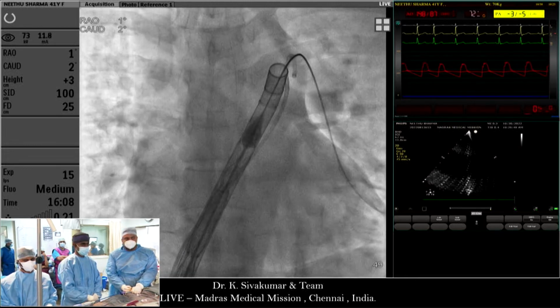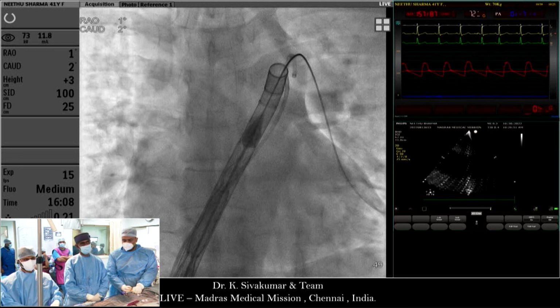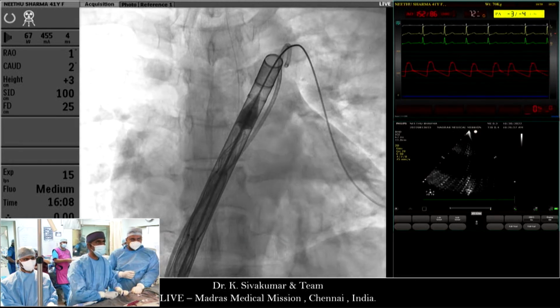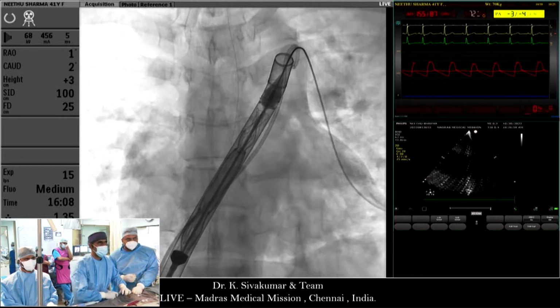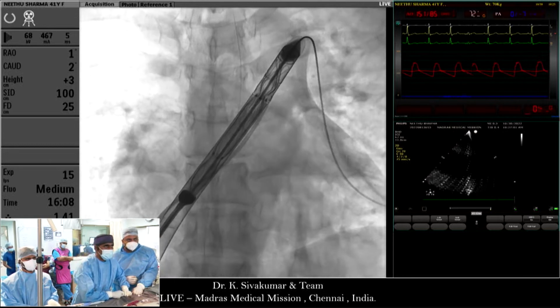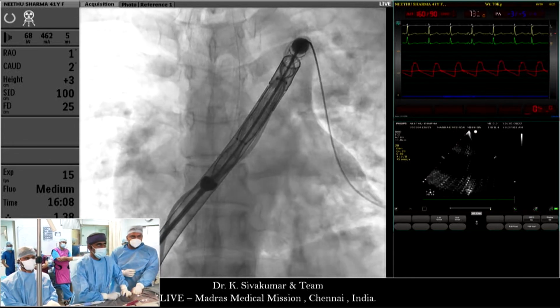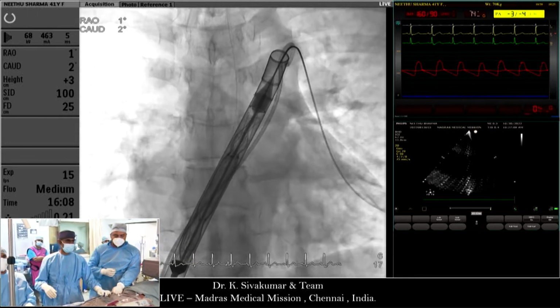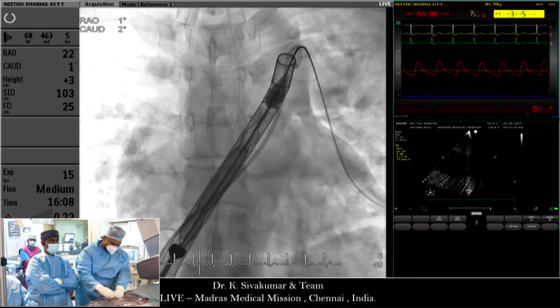Yeah, I have comments about the simulation that we did. It is always given at a given phase of examination. It was the best systolic image, which is not really the widest diameter. So what the simulation requires in such cases, as was being said, is the functional study with the whole cardiac cycle, because you can easily underestimate the sizes.